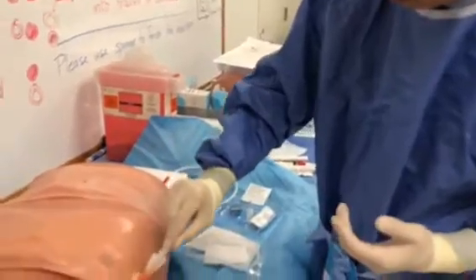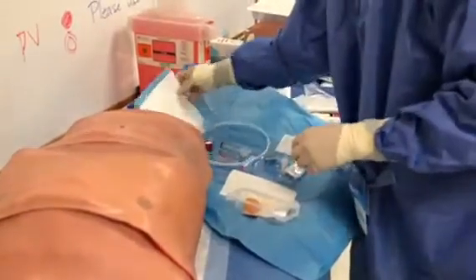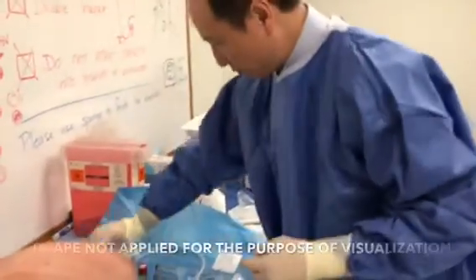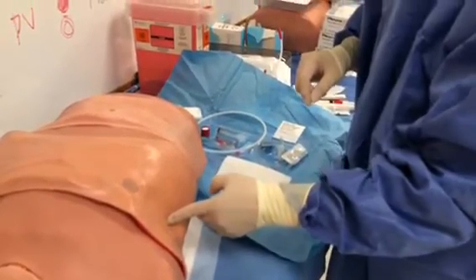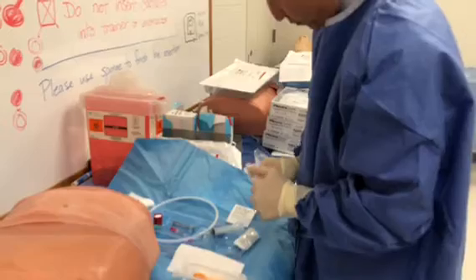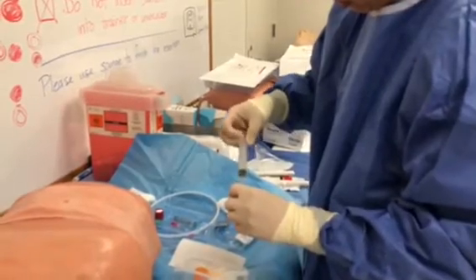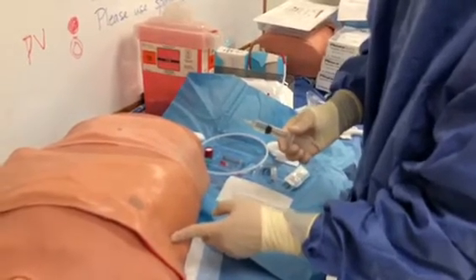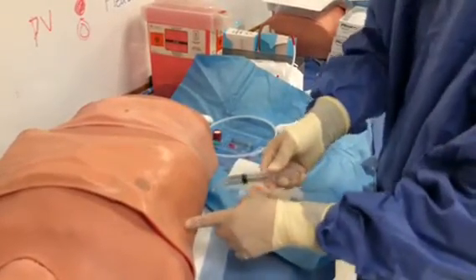You sterilize the area and have a sterile drape. What I typically do is feel above the rib where I'll be inserting. You break up the cap for the local anesthetic. I usually don't need to sedate the patients — if you give a really good local intercostal block, they tend to do fine through the procedure.